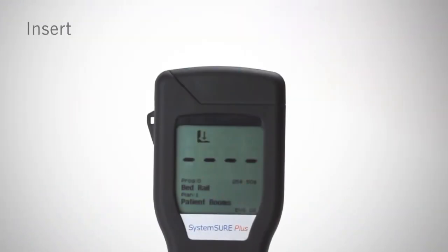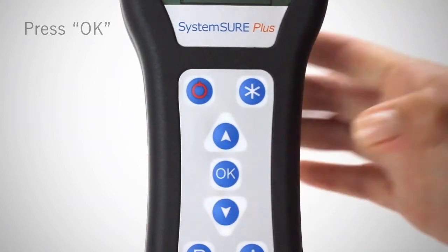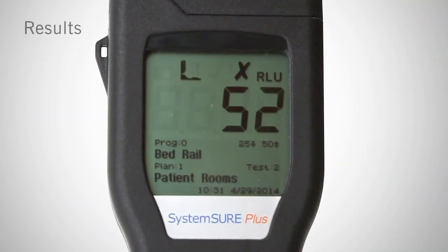The final step is measurement. Insert the swab into the reed chamber within 15 seconds after activation. Then close the lid. Hold the luminometer upright and press OK to initiate measurement. Results will be displayed in 15 seconds.